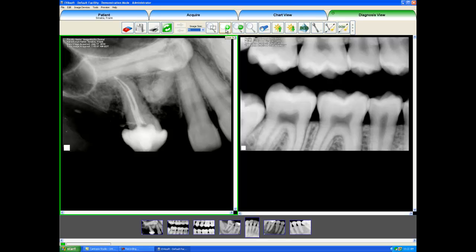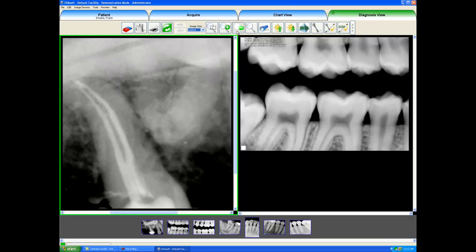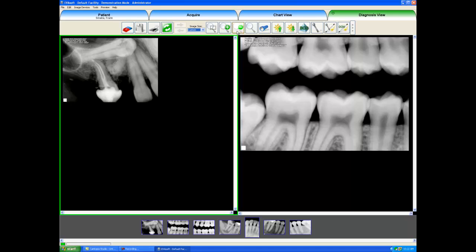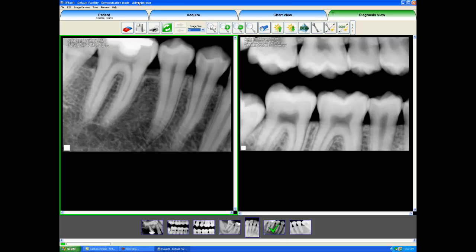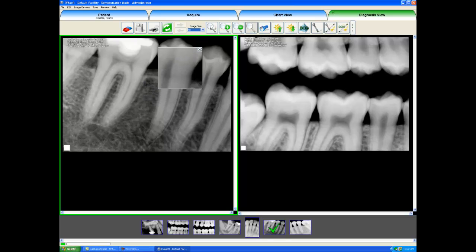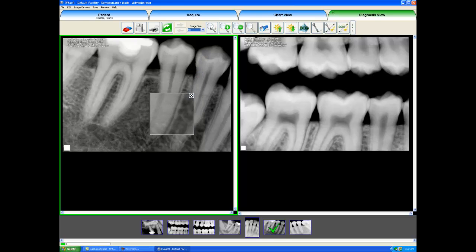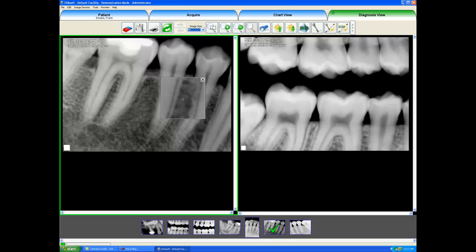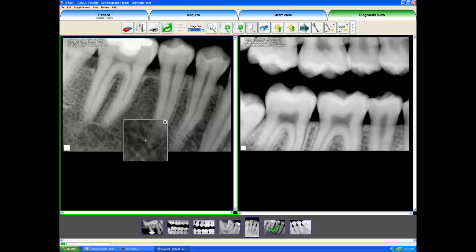We can also just click these buttons to zoom in or to zoom out on the image. Now I'll select a different image by single clicking it down in the film strip. It will bring the image live into our active window, and I will show you the magnification spotlight. When I click on this tool, our magnification window shows up over the image, and I can move the magnification spotlight around the image and investigate it that way. When I'm done, I can just click the X here to turn it off.